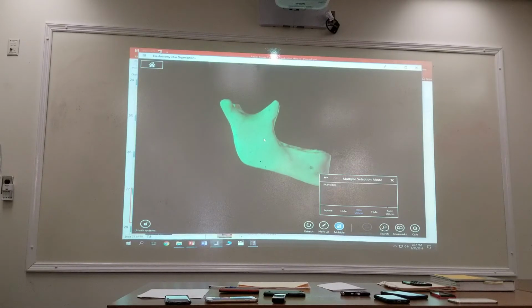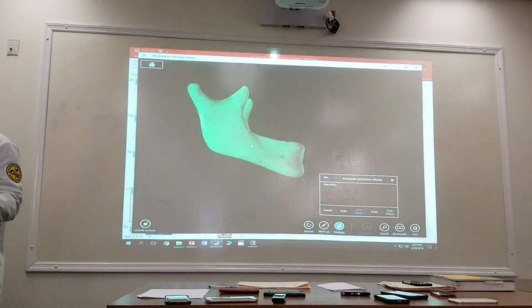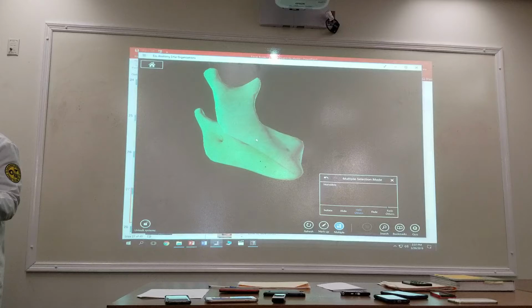Okay, you guys watching? So we said we're going to start off with a 25-degree tilt, right? So there's our 25-degree tilt. This is just your basic. If we want to do a general survey, you guys refer to your slides there. If we want to do a general survey, it's going to be a 10 to 15-degree rotation. Okay, that's just a general survey.